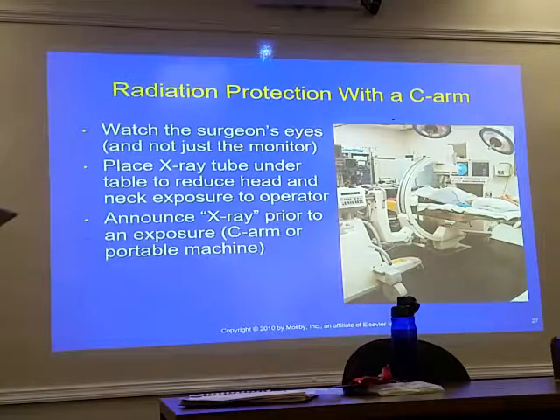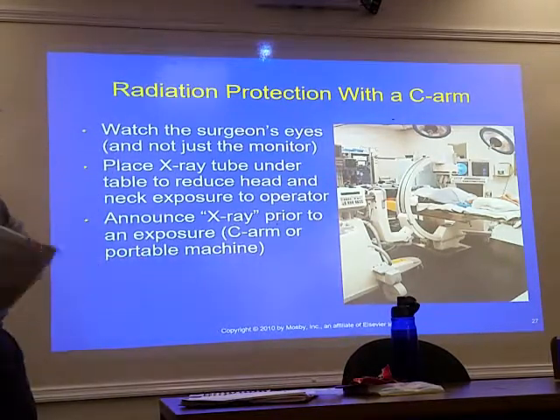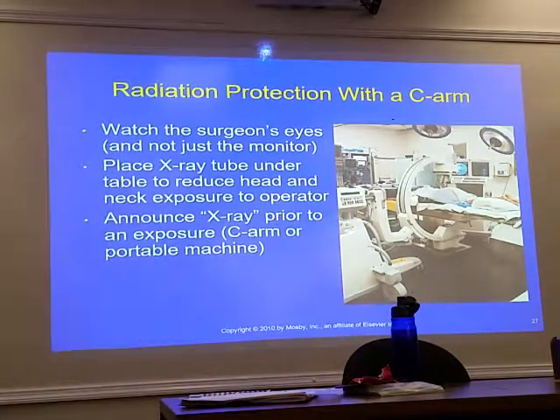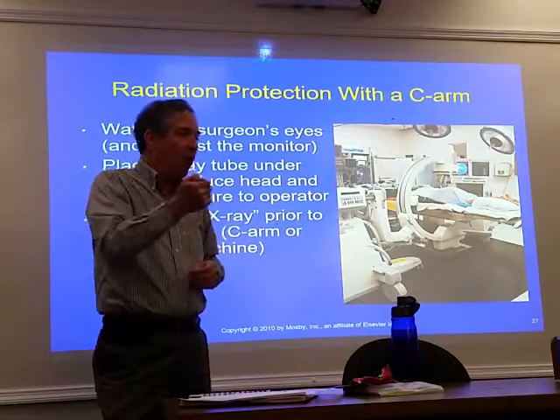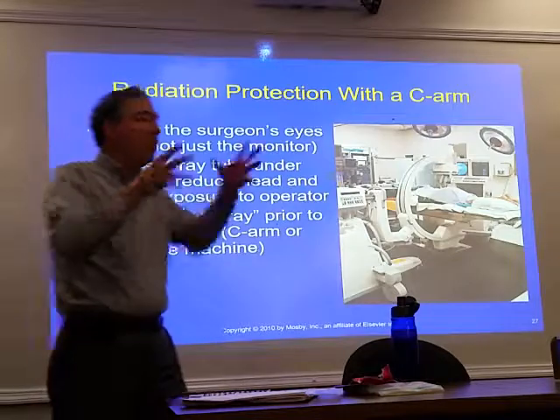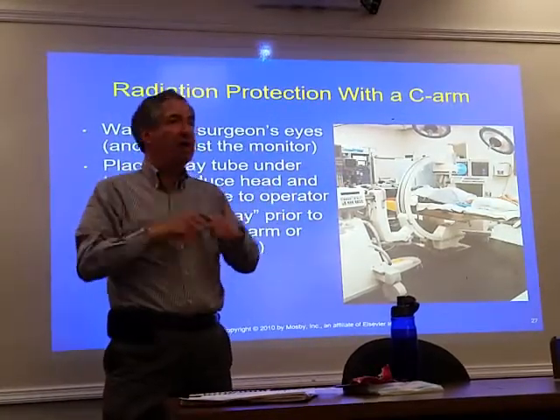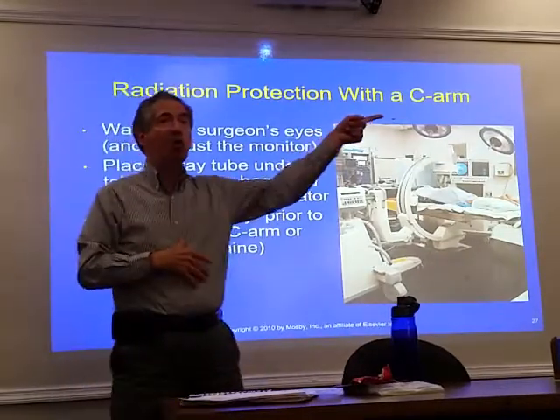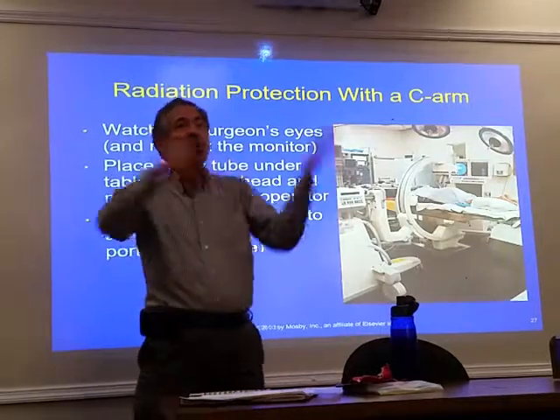All right, on here, I wanted to mention, always watch the surgeon's eyes, especially if you're in control of the fluoro switch. A number of times, like in pain management, they would be fluoroing, or you'd be in control of this, and they'd say, keep it on, and then they would look away from the monitor. I always turned it off, because a lot of times they'll look back and say, that's still on. And that's patient saving. They're not really great sometimes at telling you to turn it off.